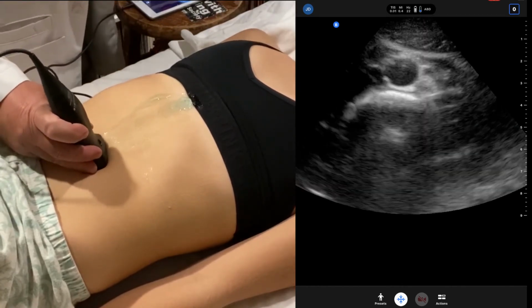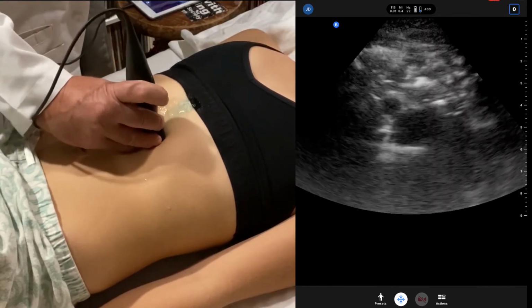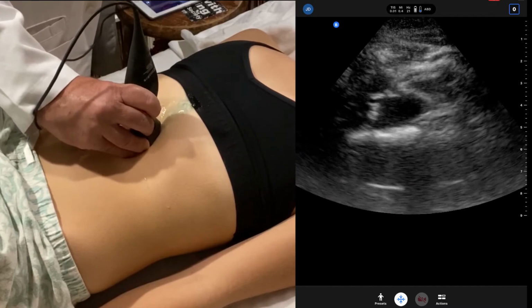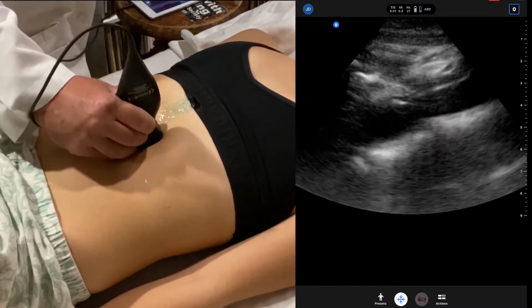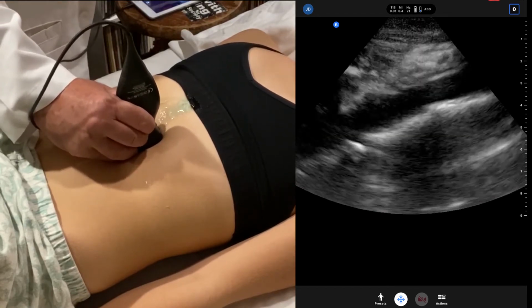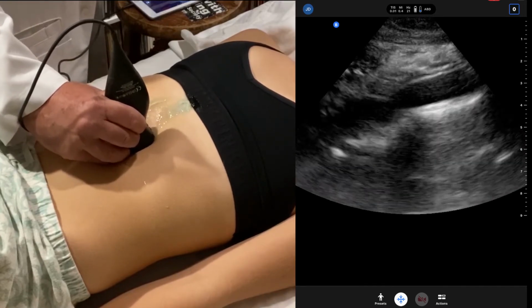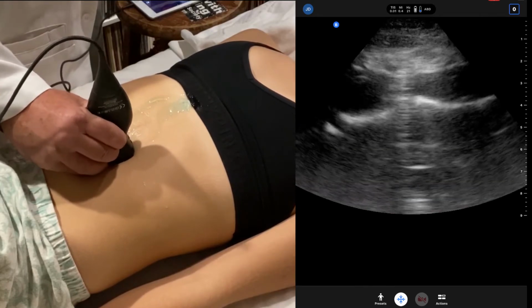Now we're going to identify the aorta. So we're going to twist. Maybe we'll start at the top and we're going to twist our probe. We start in the transverse and then we'll turn 90 degrees clockwise and we'll lay out that aorta by each side. You can see the aorta there in the longitudinal view. You see our markers. There's our celiac trunk and you can see our superior mesenteric artery. We'll move down the aorta.